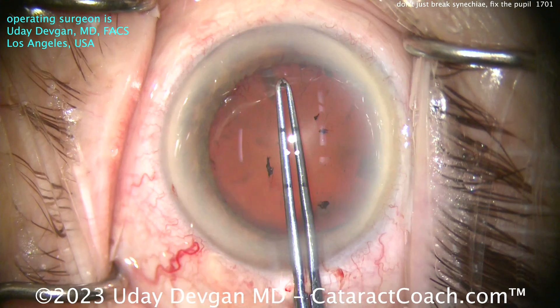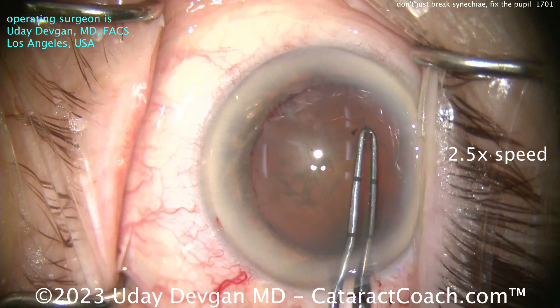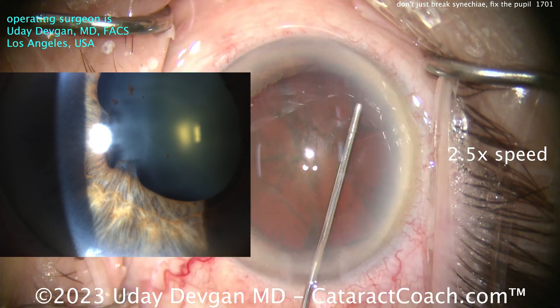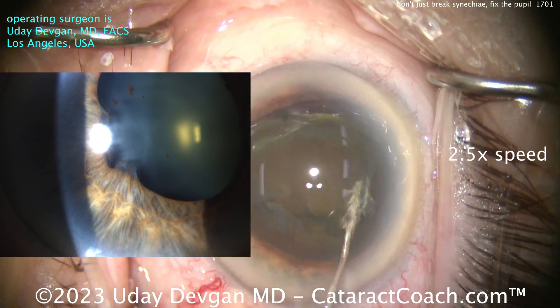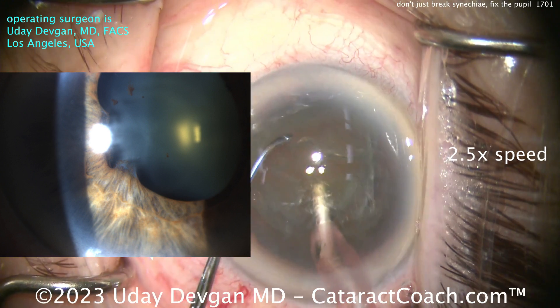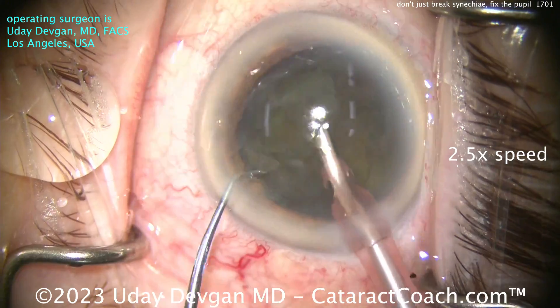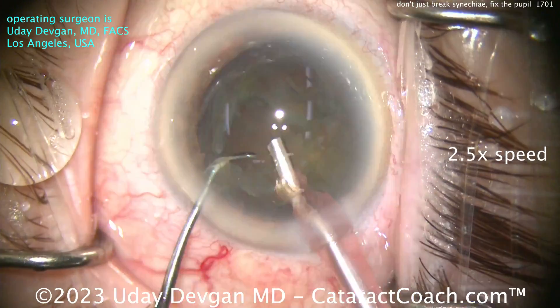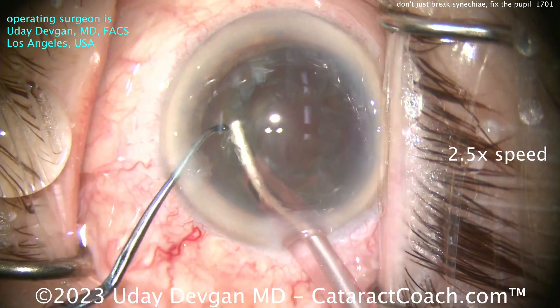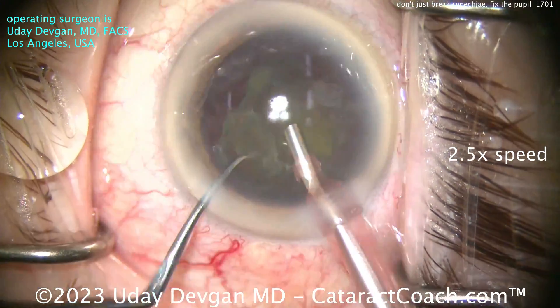So it's not going to cause that same distortion. Now you can see the pupil has expanded more — it looks like a pretty routine case. So we can get that rhexis done. The video here is sped up, showing it at two and a half times just to get the case done. Here's the pre-op picture — you can definitely see the membrane there. That fibrotic membrane holding the anterior lens capsule to the iris has to be removed. Peeling it off will restore totally normal anatomy for this patient. Now the nucleus itself — we're just going to chop it up and remove it at two and a half speed. Notice how the pupil stays wide open; despite that manipulation, you're not getting much miosis or contraction. Able to remove this cataract pretty easily — not a very dense cataract.